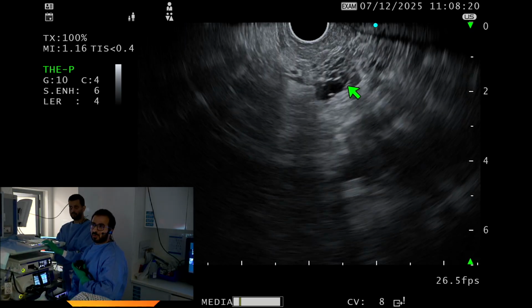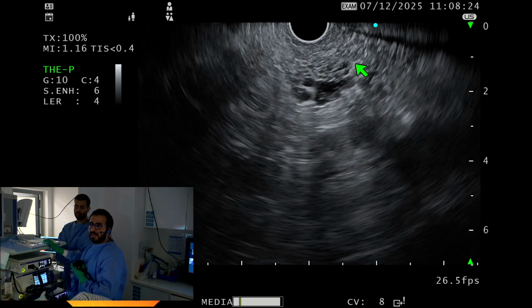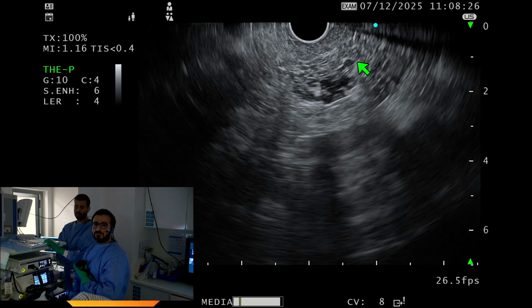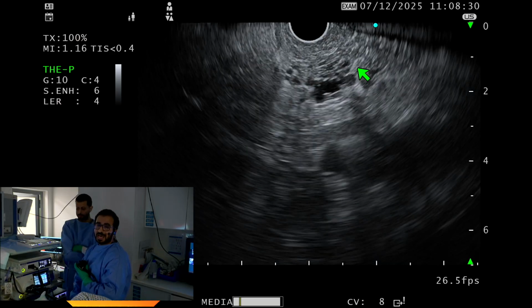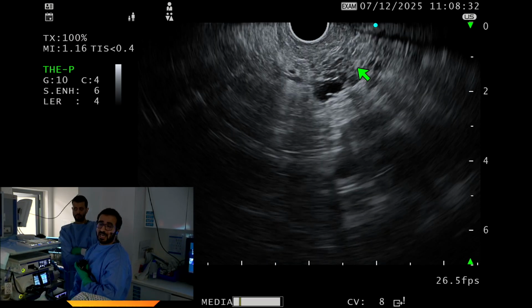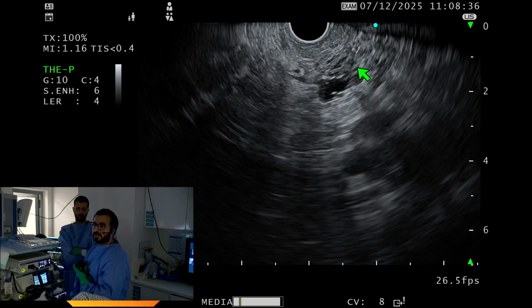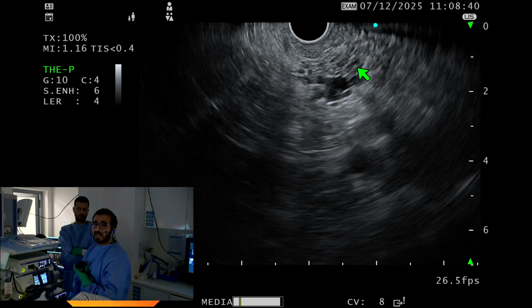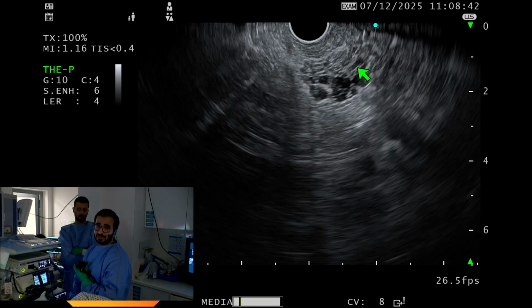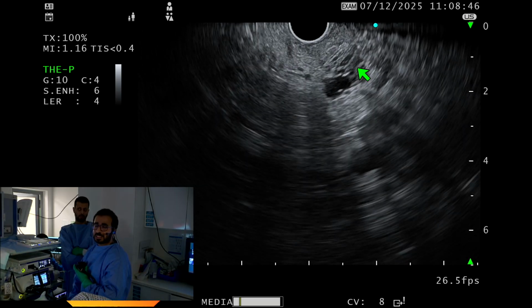It's probably difficult with all these dilated side branches and microcystic components, but in this situation, I would probably FNA the largest component, the 1 centimeter here, at least to send it for CEA. Yeah. Because if it is IPMN, that is more than 3 centimeters, it's different from serous cystadenoma, given his atypical presentation. So he's young. We don't want to miss a precancerous lesion.